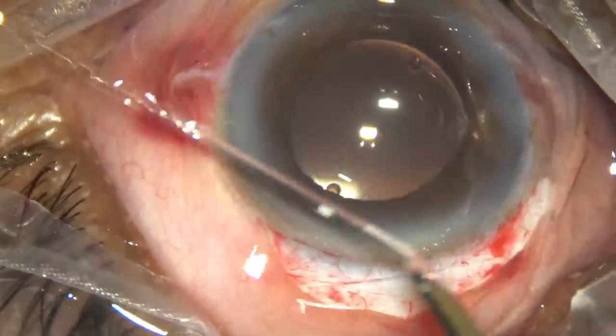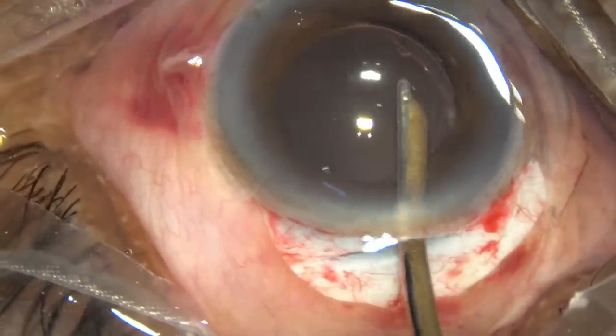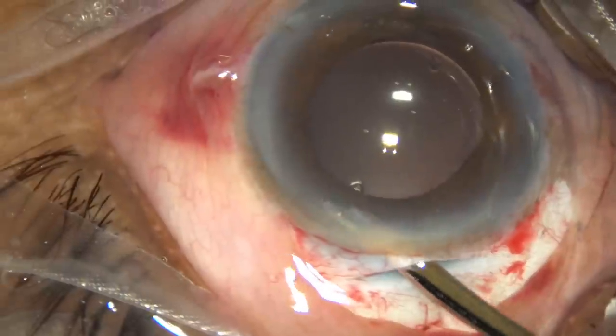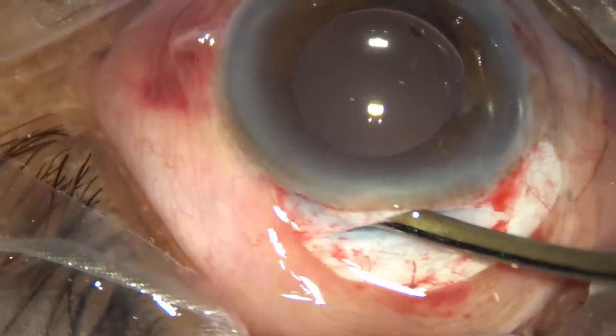This is the final step. Nice lavage of the anterior chamber, and aspiration and irrigation for some time. Then we come to the wound. We lift the anterior wall of the wound and leave it.